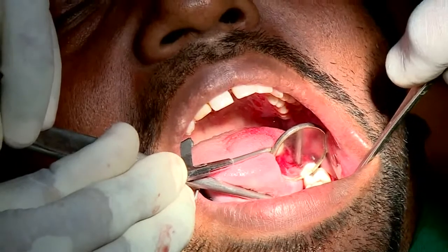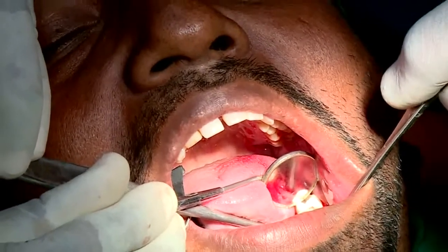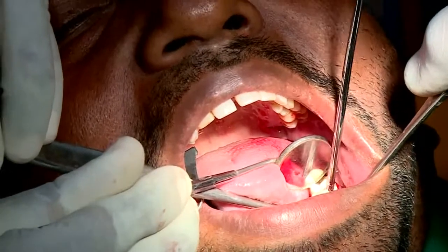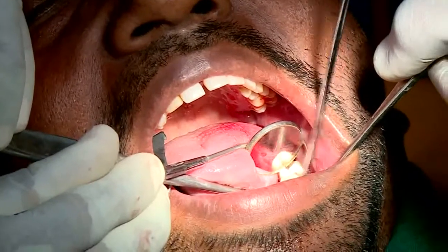The direction of the drill also, once the first drill goes in, the second and third drills literally follow the first drill. It is extremely difficult to change the direction after you have created a pathway. Do you agree, Dr. JK?